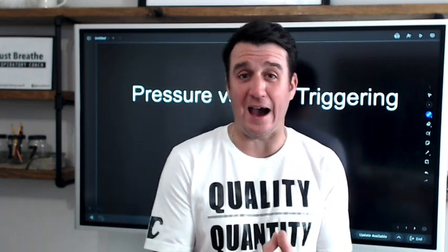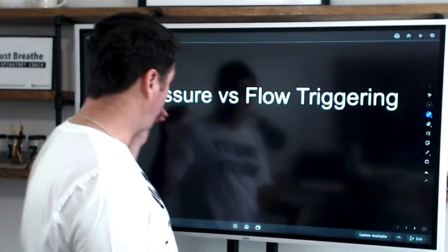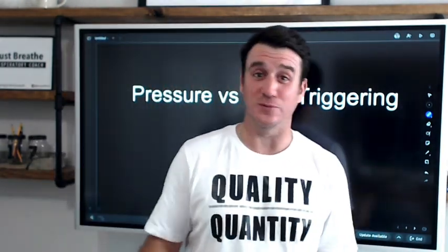Now, this video is all about how the ventilator recognizes when the patient wants to take a breath during mechanical ventilation. It comes down to pressure versus flow triggering. That's what it's all about.